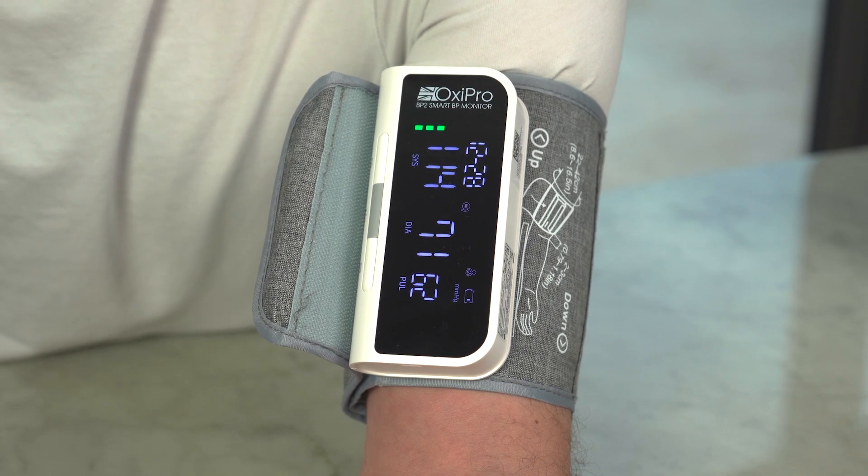To allow comparable readings, you should test at the same time each day, as your blood pressure will vary during the day. Always follow the directions of your doctor or medical practitioner. If you have any questions or queries, please feel free to contact us.